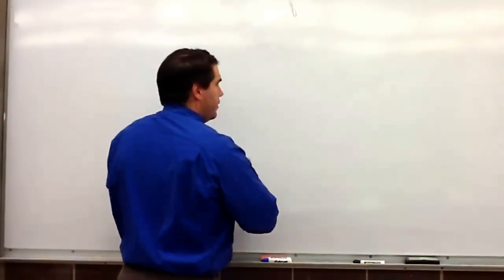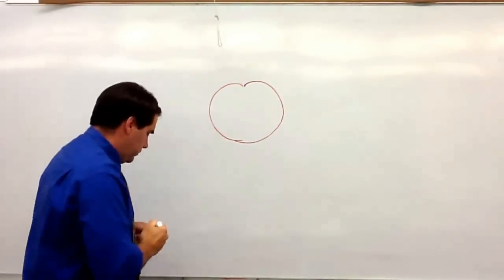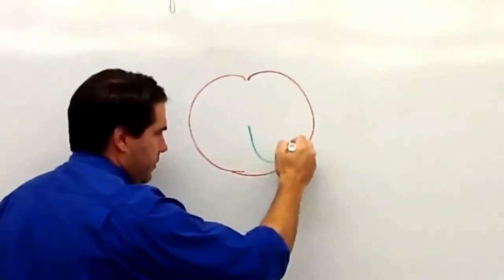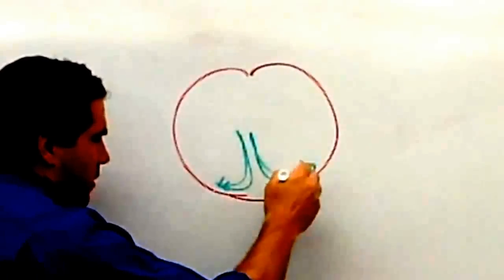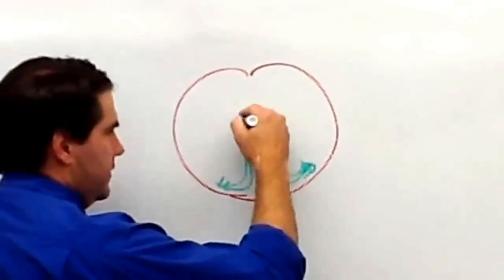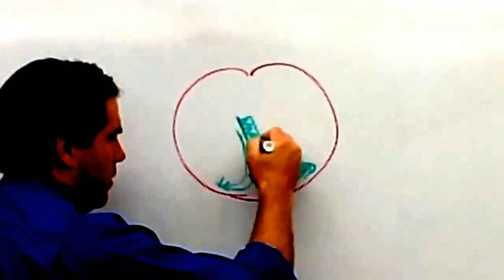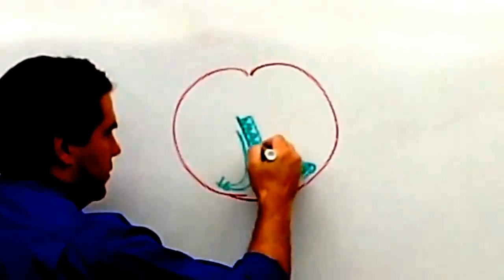So if I put right in the middle a heart, apical depolarization is voltage comes down the septum and heads up the walls. And because the ECG doesn't pick these all up individually, it adds them together. The way this is seen by the ECG is one big arrow heading down the heart. So that's the normal situation.